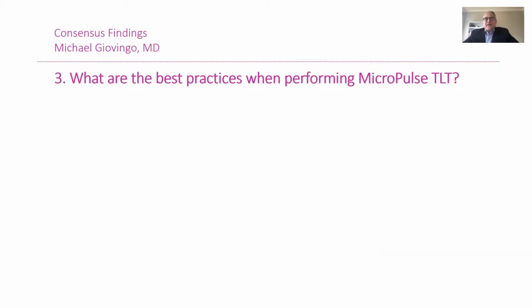So actually, my anesthesiologist usually just uses a little bit of fentanyl because it keeps the patient awake, keeps them controlled from the pain level side, but also slows down a little bit the anxiety level that the patient may have experienced before. And you can dose that pretty quickly. If you inject it, it takes less than a minute until you have the effect, because it has to come centrally to have its effect. In general, I talk to the anesthesiologist not to use the full dose in the beginning, but to slowly titrate and see what the patient's anxiety level and nervous level is. It also has the advantage that the patient recovers pretty fast later on.